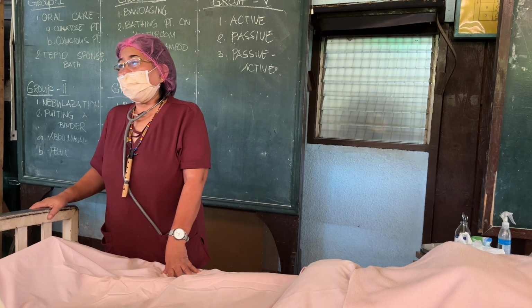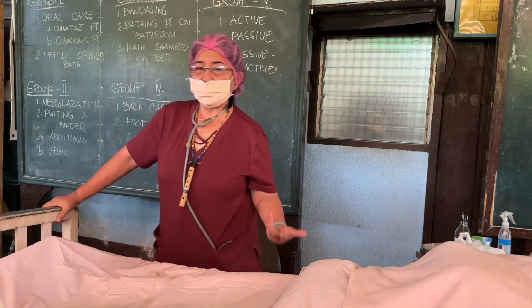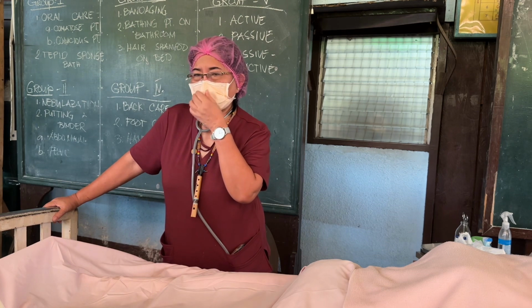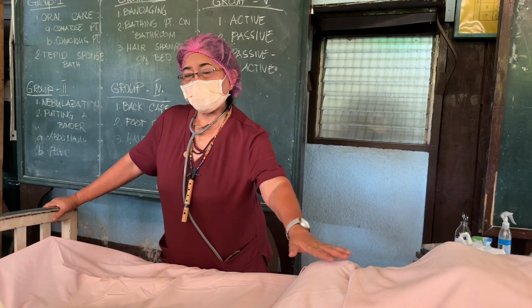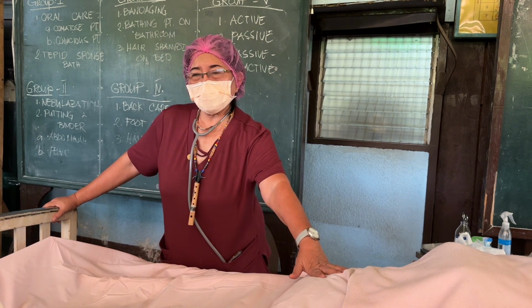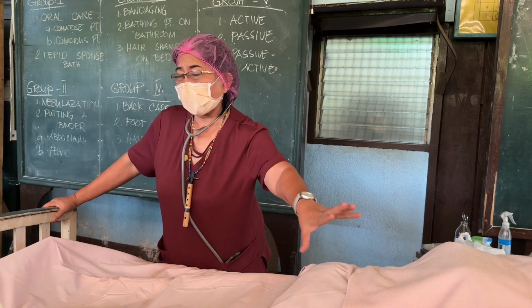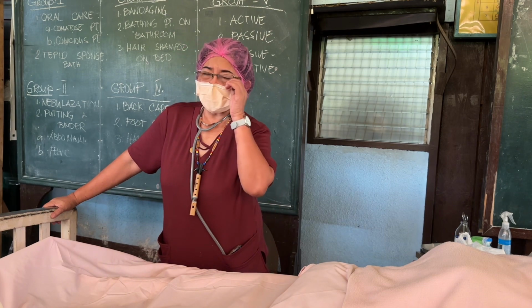Okay. Next procedure, flushing and irrigation. This is a different case. The patient had abdominal surgery. They did irrigation, flushing, irrigation, and toiletry, using normal saline solution.